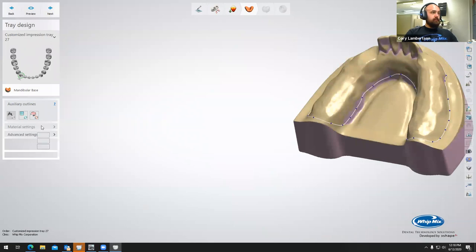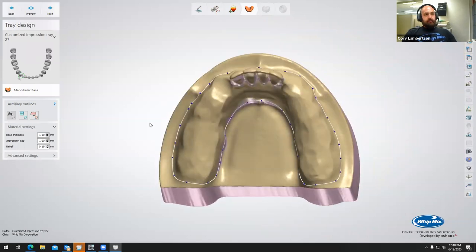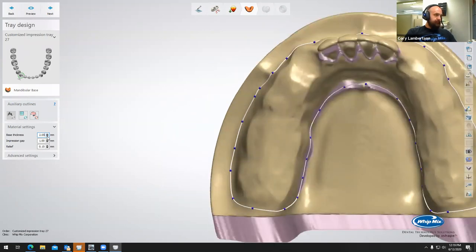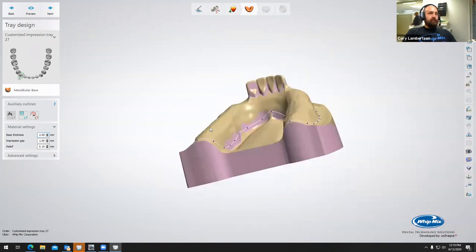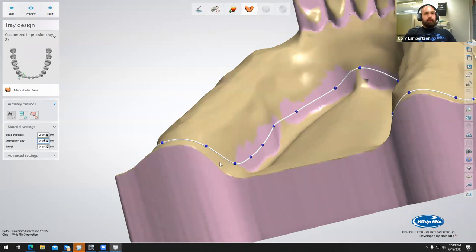For those doing custom impression trays by hand, you're probably thinking you'd already be done at this point. But I can print probably 15 of these on the new ASEGA Pro 4K printer in probably less than an hour. Now we have a couple of material settings to program in: the actual thickness of the impression tray itself — I recommend at least 2 millimeters for any 3D printed materials — and then the impression gap, which is the space between your custom impression tray and the model, usually about a 2-sheet thickness of wax, so 2 millimeters. If you were creating a simple denture base, you'd put that down to 0.